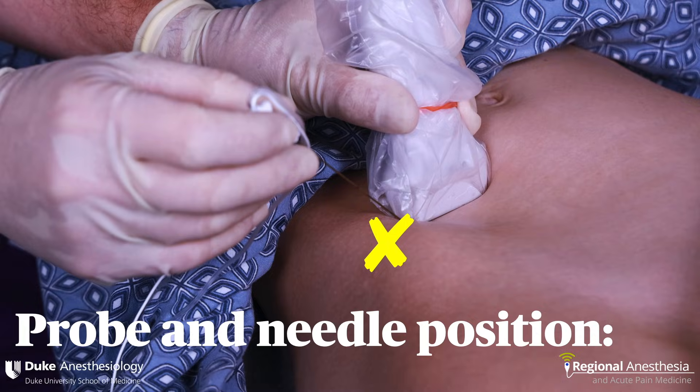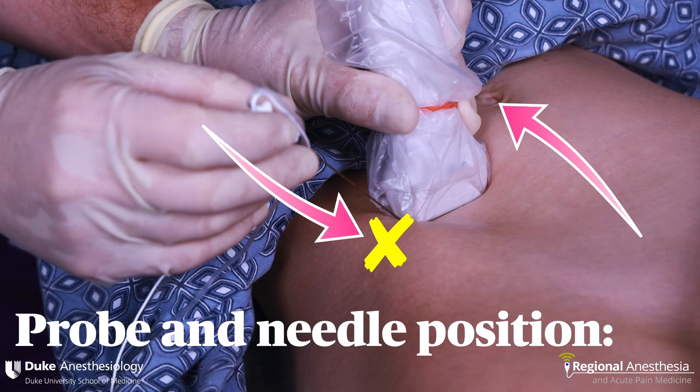A linear probe is placed on the lower abdomen immediately medial to the anterior superior iliac spine. In order to get the best view of the nerves, vessels, and muscular planes, the probe is rotated slightly so it's parallel to a line connecting the ASIS with the umbilicus. This is a fairly shallow and simple block, and the needle can be advanced in-plane from either the lateral or medial side, or brought down out-of-plane into the correct fascial plane.